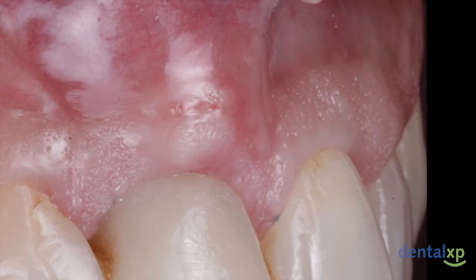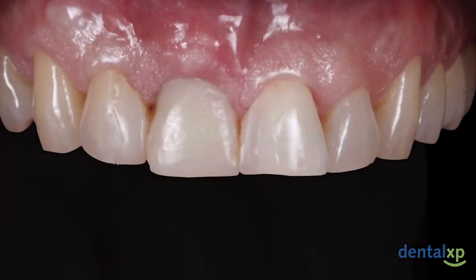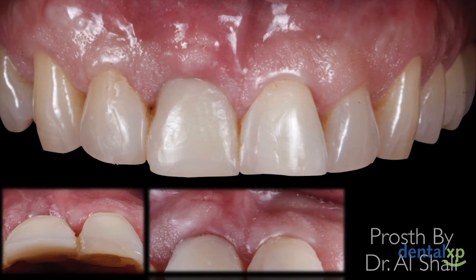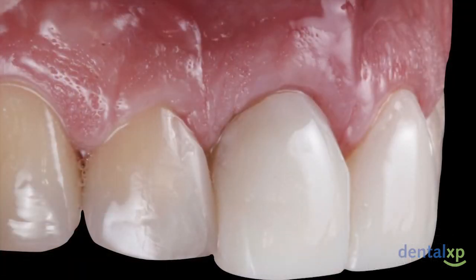And at 2 weeks following suture removal, if we take a look at the occlusal aspects, you could see that we were able to create a more natural emergence of that implant restoration. So at 5 months post-op, the patient returned to finalize the case, and although we experienced some shrinkage of the graft, we were still able to achieve adequate buccal augmentation with a relatively natural emergence compared to the adjacent dentition.